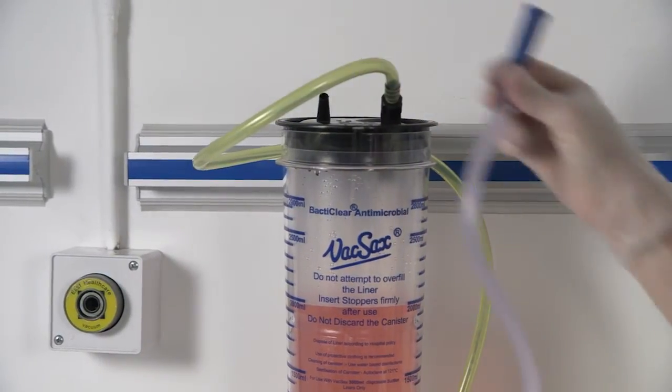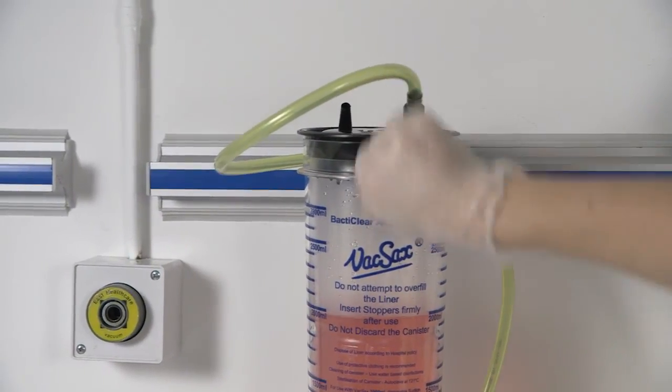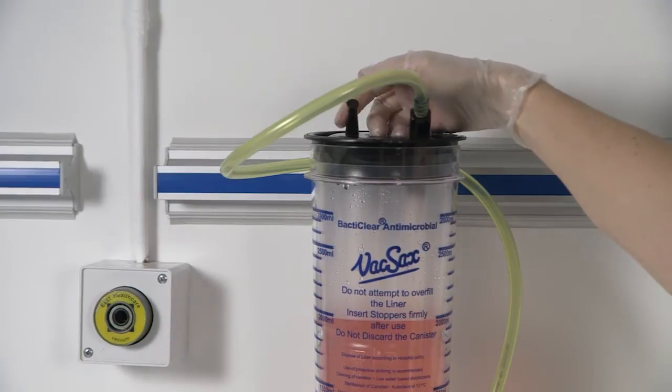When the liner is full and ensuring the vacuum is turned on, twist off the black cap located on the front edge of the liner and insert it into the patient port.